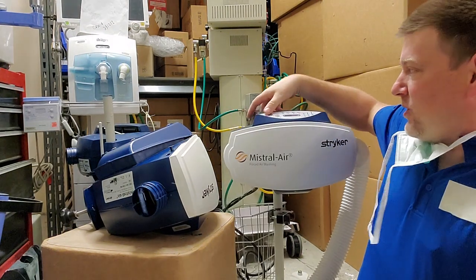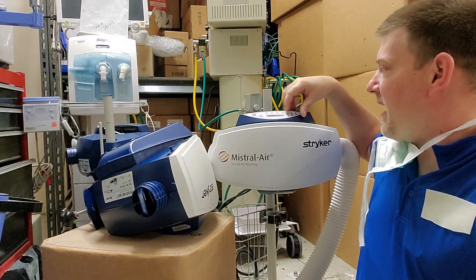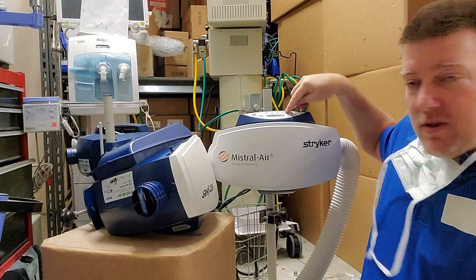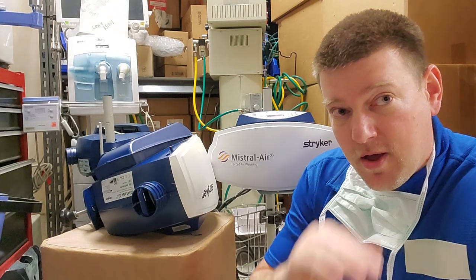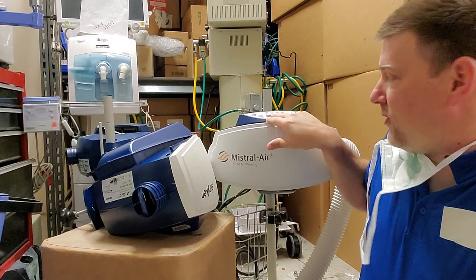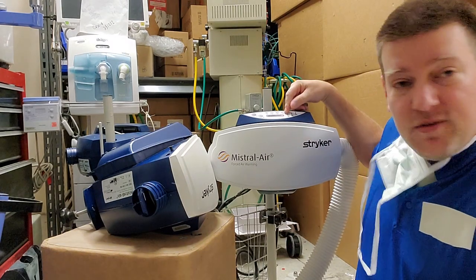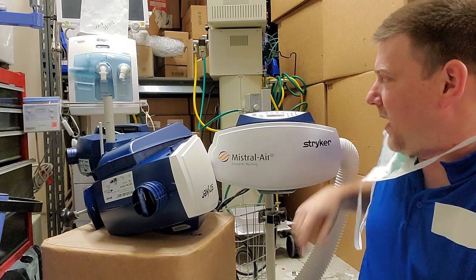On the front you have a control panel where you can silence your alarms, and we have a couple different temperature settings: 32, 38, and 43 degrees. Remember I said 37 degrees is a normal patient temperature, so 32 makes them hypothermic and 43 makes them hyperthermic — it goes above and below body temperature.